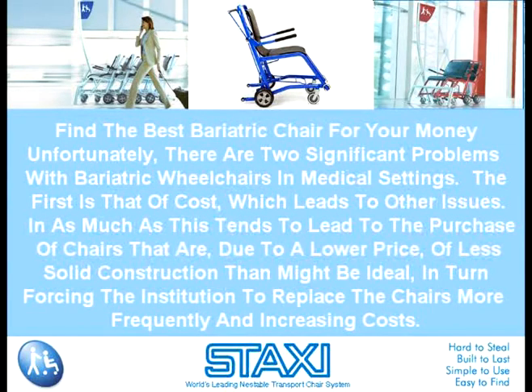Unfortunately, there are two significant problems with bariatric wheelchairs in medical settings. The first is that of cost, which leads to other issues. Inasmuch as this tends to lead to the purchase of chairs that are, due to a lower price, of less solid construction than might be ideal, in turn forcing the institution to replace the chairs more frequently and increasing costs.